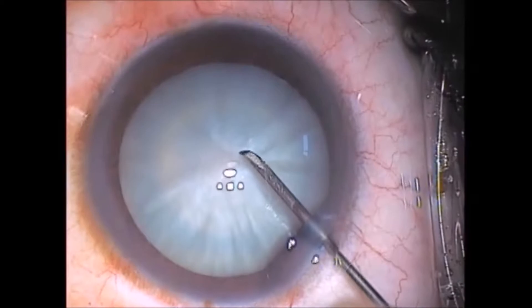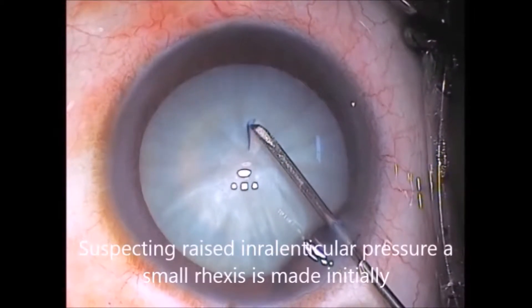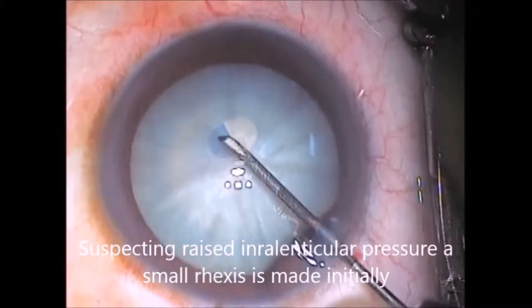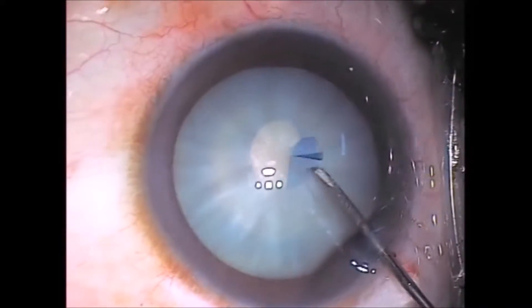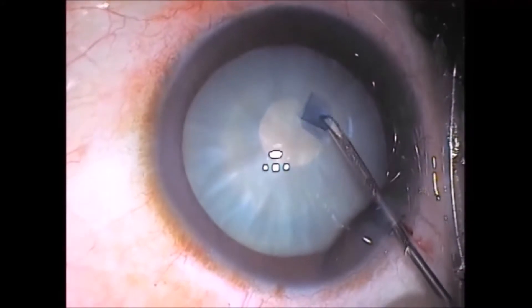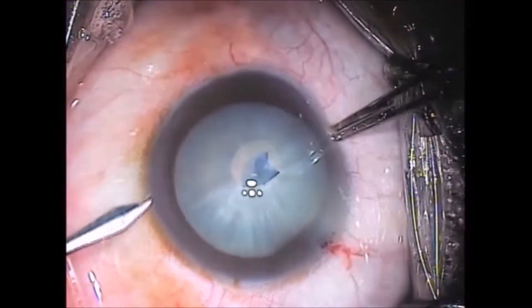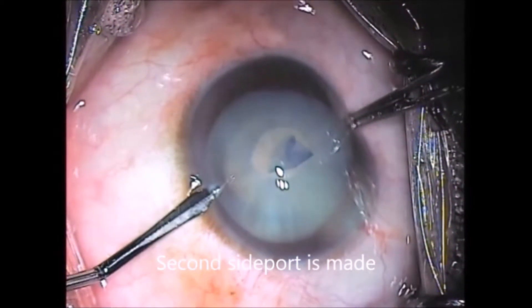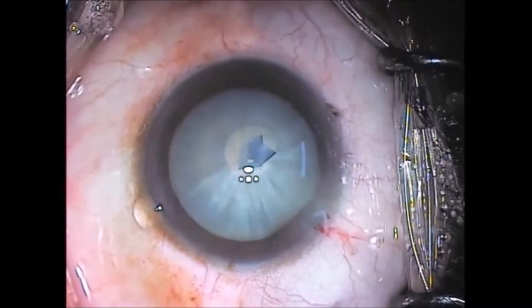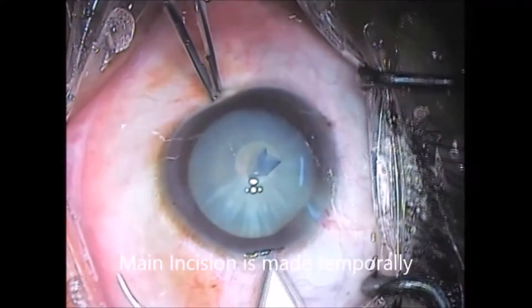First, a small central rhexis is made to relieve possible intralenticular pressure. Another side port is made. The main port is then made with a 2.8 mm keratome.